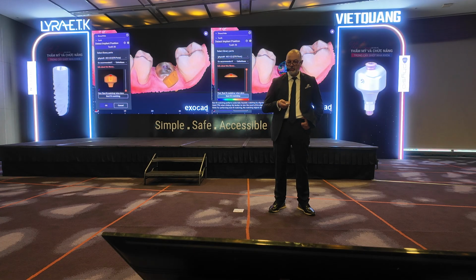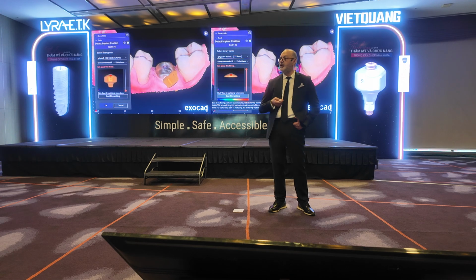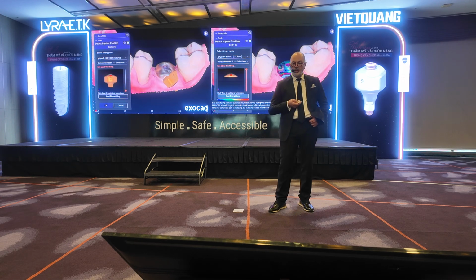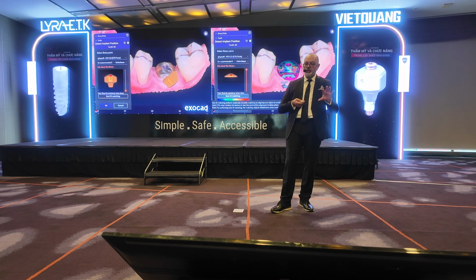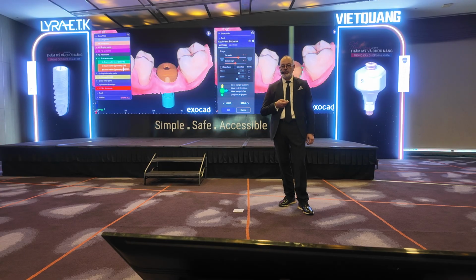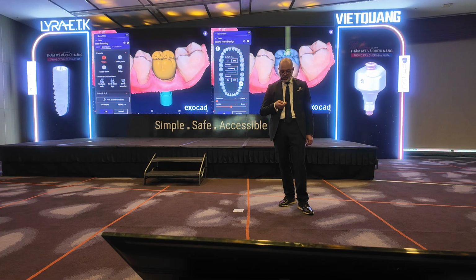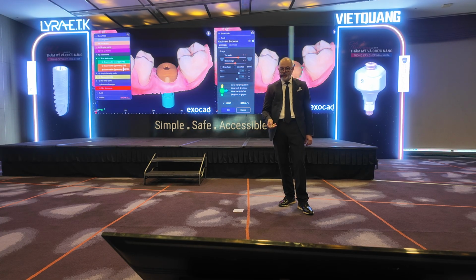Then the job of the lab technician starts, where he will match the virtual iPhysio with the final iOS, and start to work by defining here the limits using these small arrows.